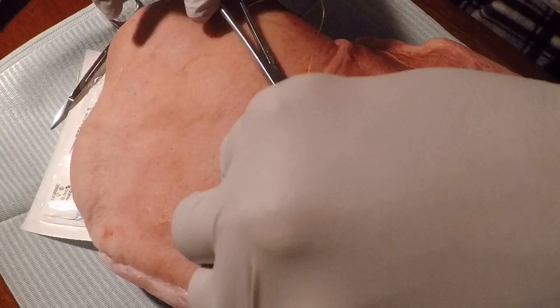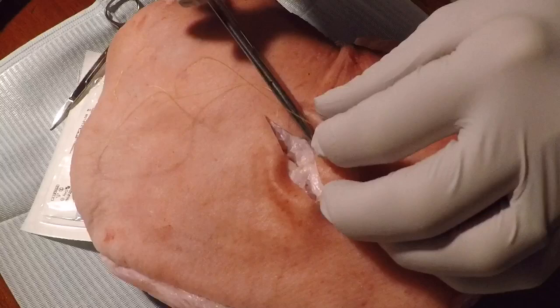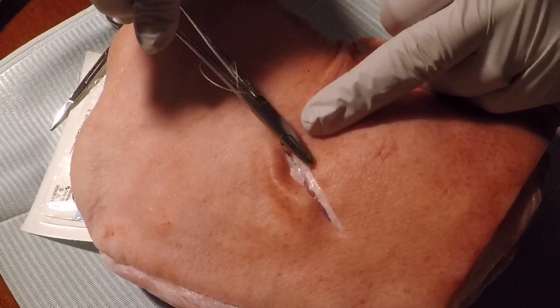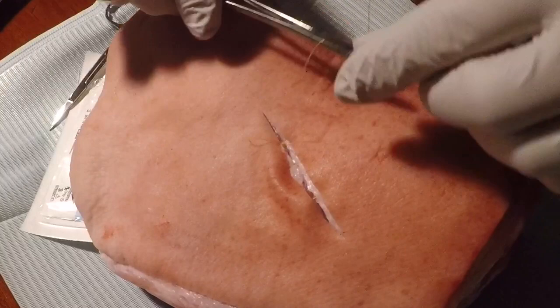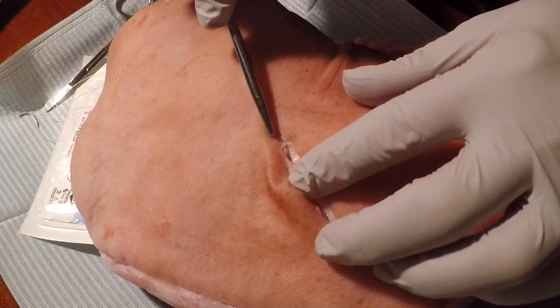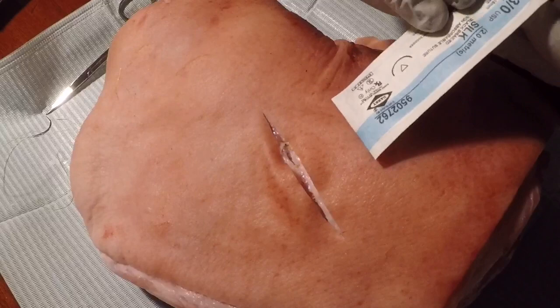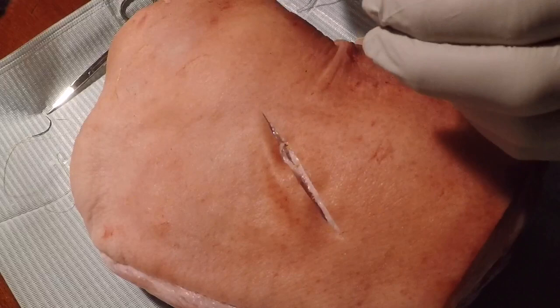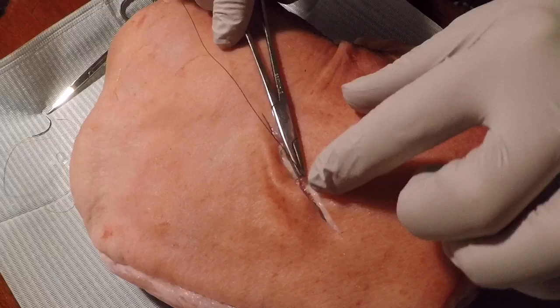We'll do a third deep suture and then move on to the superficial sutures — a deep bite. With that done, you can see that the tissue deep is sewn up and tied together, and that's going to hold it. Now we need to close up the skin itself. For closing the outside, we're going to use non-resorbable sutures. With these, you don't need the knot inside — you actually want the knot outside. When doing the absorbable sutures deep down, you started inside so the knot ended up deep inside the suture area.